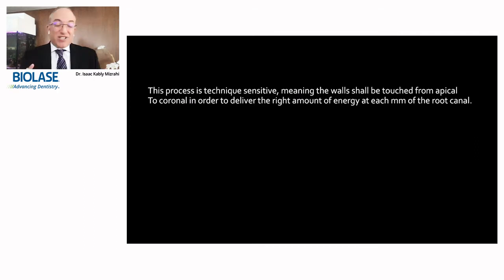This process is technique sensitive, as I mentioned before, meaning the walls shall be touched from apical to coronal in order to deliver the right amount of energy at each millimeter of the root canal. This is very important. This is technique sensitive.